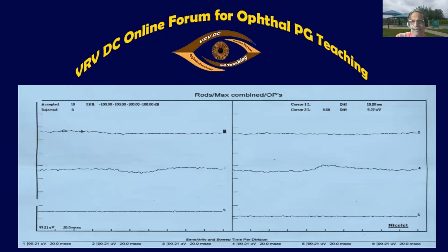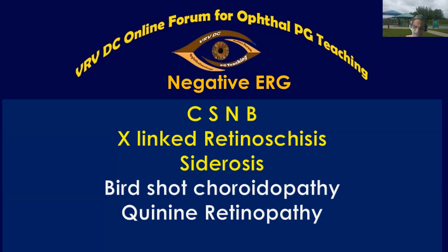Now, see, a few other important points regarding ERG. So what is negative ERG? Normally, A wave is negative, you know that, whereas the B wave is a positive wave. If the amplitude of the B wave is coming down, that means going towards the baseline, going towards the negative side, it is called negative ERG. What do you mean by that? The amplitude of the B wave is coming down.